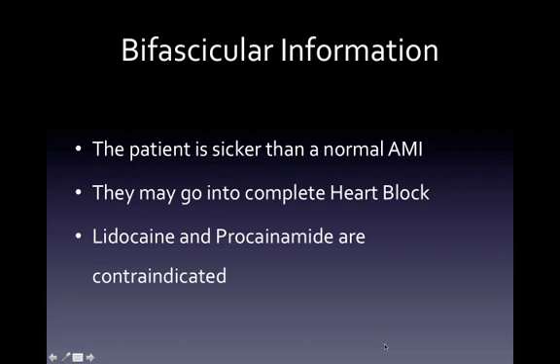In a bifascicular block, the patient is sicker than in a normal acute myocardial infarction. They may go into complete heart block very rapidly. We talked about that. You should have the quick combo pads placed upon them. It is considered a high degree heart block.